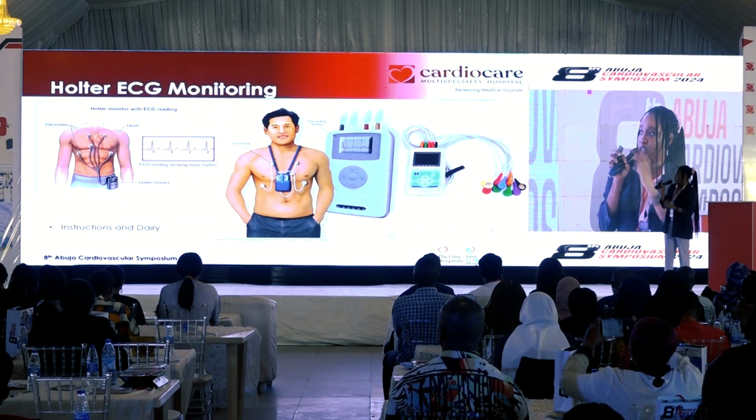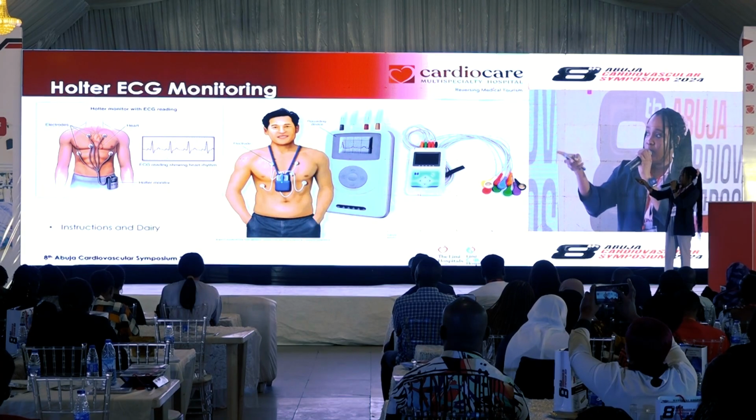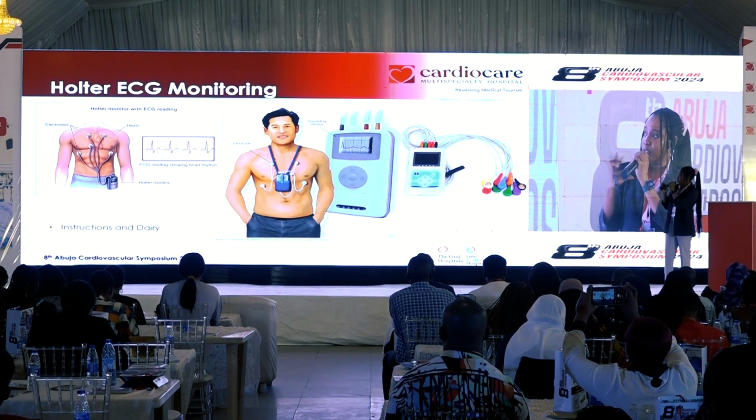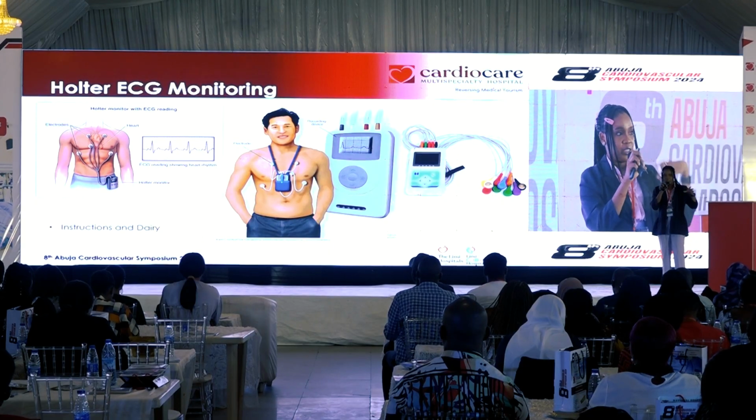Okay, then this is just a pictorial view of the Holter ECG. You could see the attachment and how it's being attached. So it's pretty much easy. Once we attach this, we put it in a pouch, then they take it home.